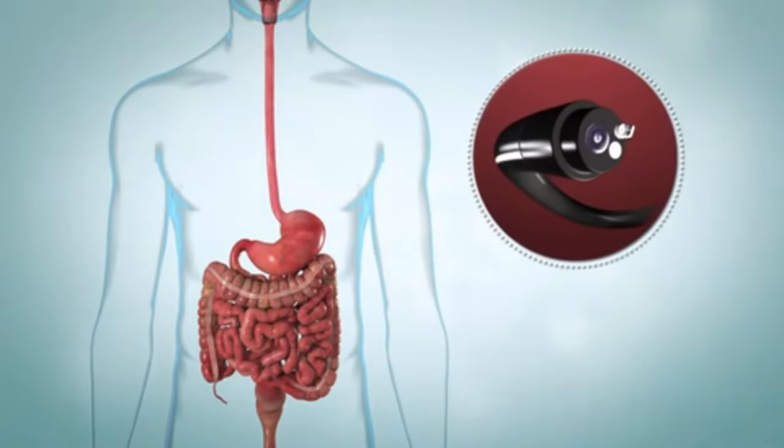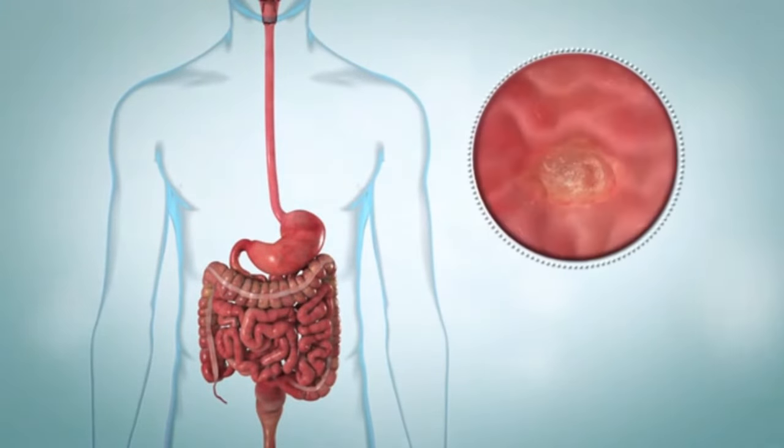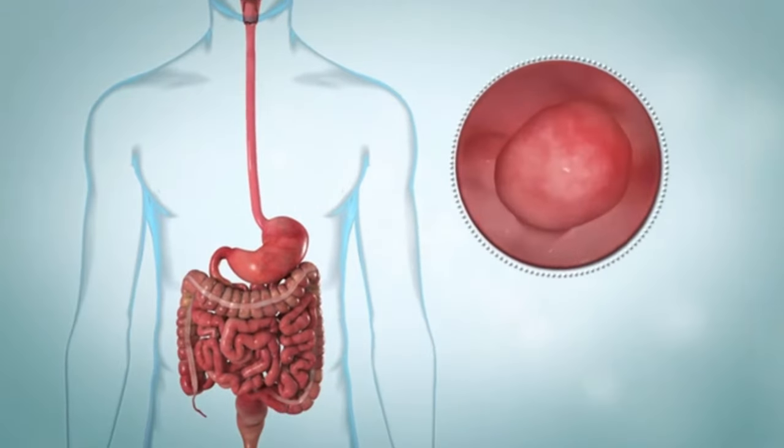It's done using a tool called an endoscope, which is a long, thin, flexible tube that has a light and a tiny camera. The test helps find problems such as ulcers, infections, or growths.